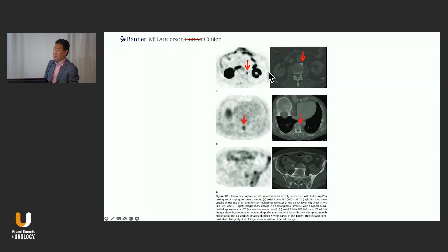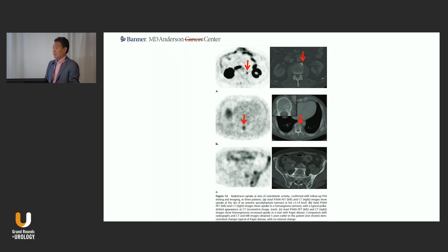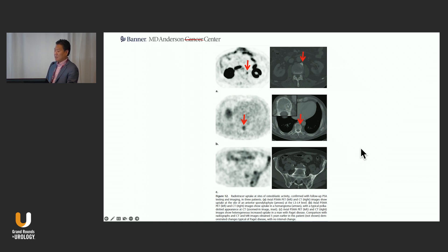You have things in the bones — like degenerative osteophytes that might have uptake. I remember the first time I saw a hemangioma on a PSMA PET it scared me, but it looked exactly like a hemangioma on CT. It's pathognomonic on CT — you should not call this a metastatic lesion. Things like Paget's disease could have uptake as well. So this reinforces that even though it stands for PSMA, we still need to be careful. There's a learning curve with this.